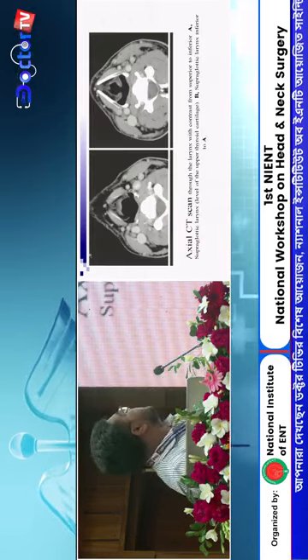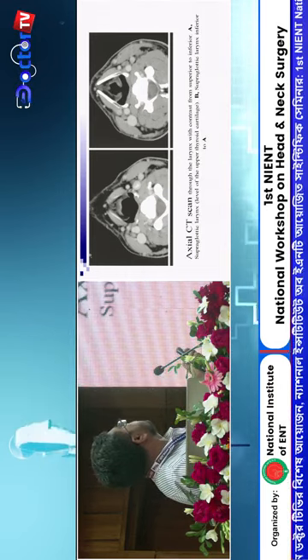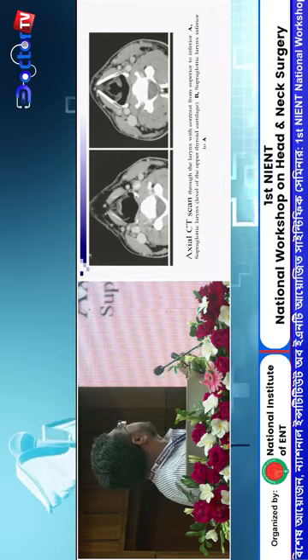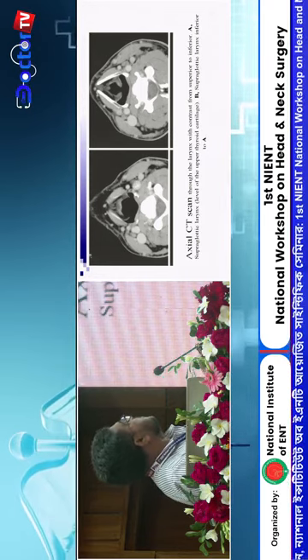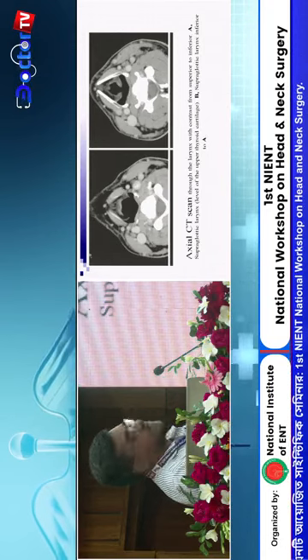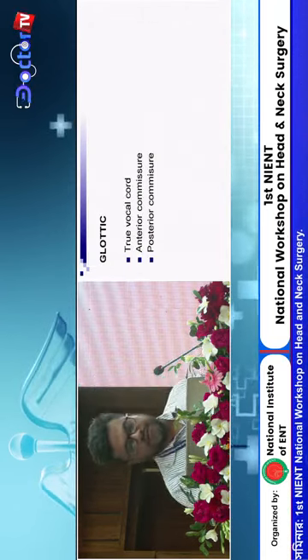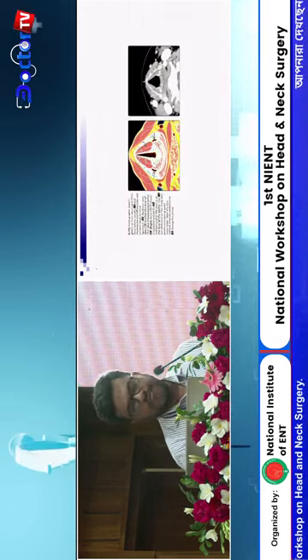And below this level, we see the epiglottic fold, the pyriform sinuses, posterior pharyngeal wall, and pre-epiglottic space. And the lowest part of the supraglottis, here is the epiglottic fold, pyriform sinus. And next, the glottic part will arrive. There is the glottic part of the two vocal folds, anterior commissure and posterior commissure.